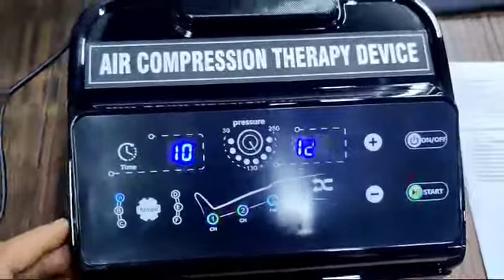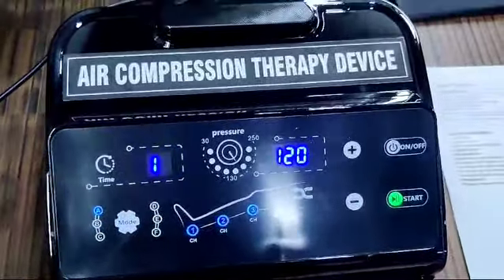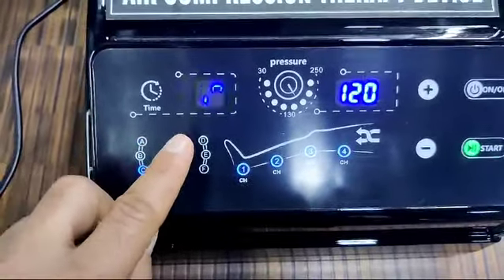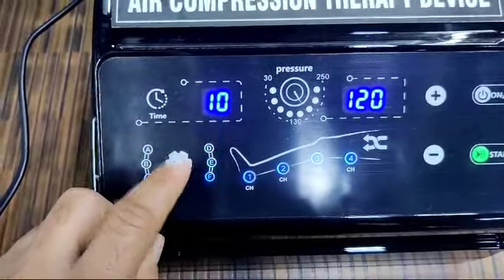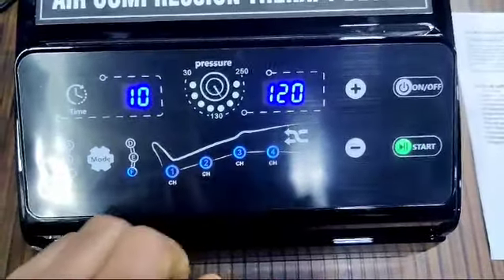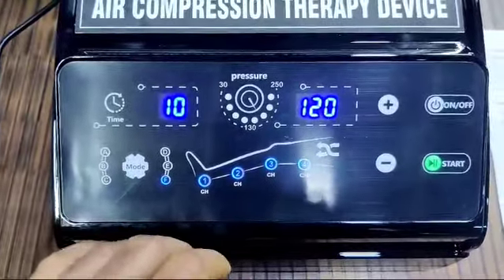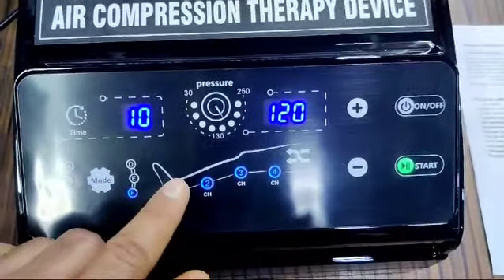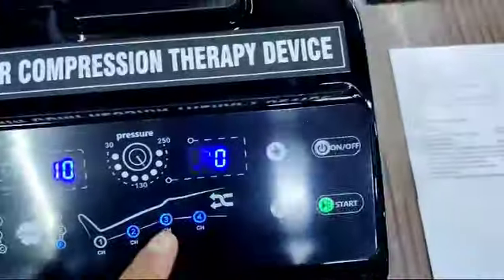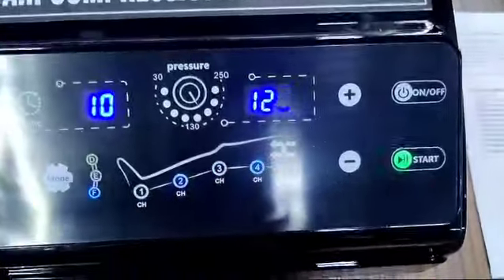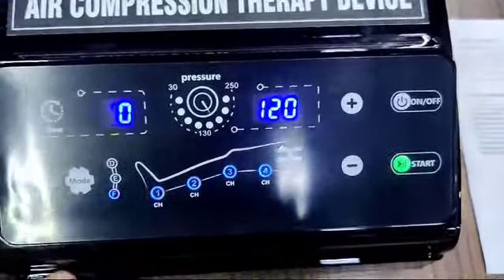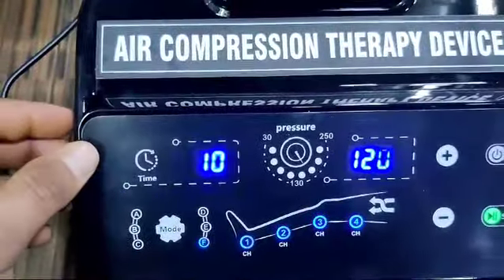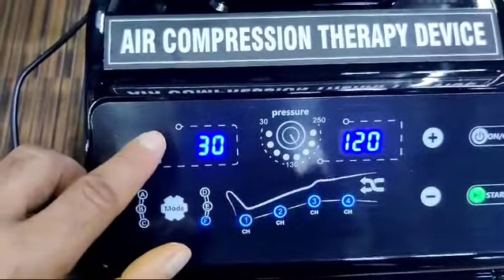This is the touch panel. You can see six modes: A, B, C, D, E, F — you can touch and select any mode you want. There are four chambers; you can use all of them, or switch any individual chamber on or off by clicking on it. You can select any chamber according to your need.